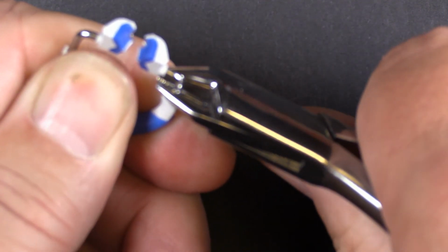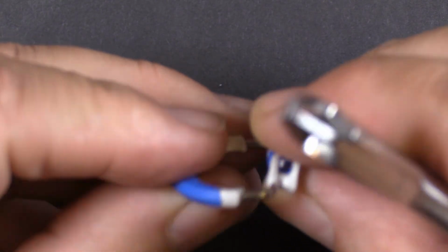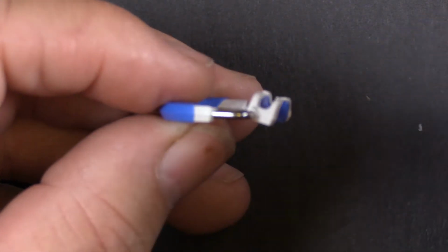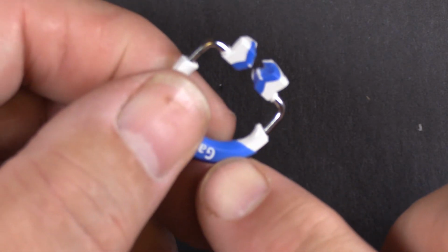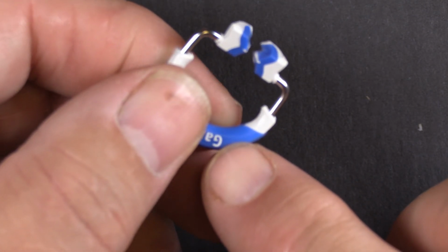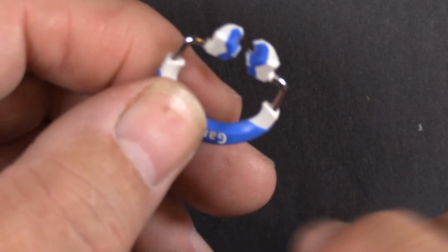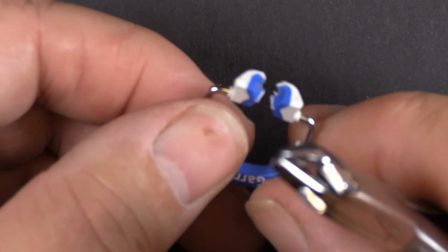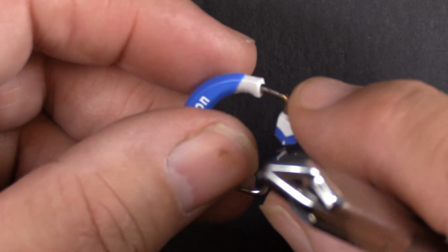And then what I would do is maybe just increase that a degree or two to help out with that. I would put one of those little rubber band sterilization identifiers on here and mark that and use that ring for those cases. They're not going to come up very often.